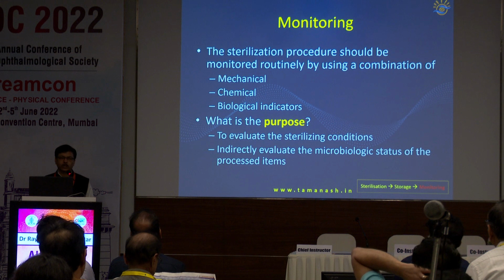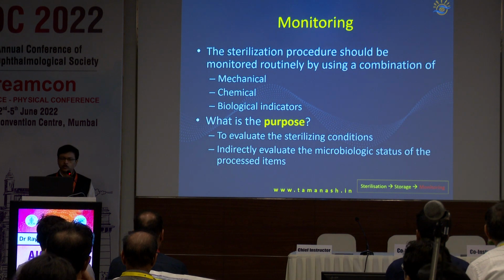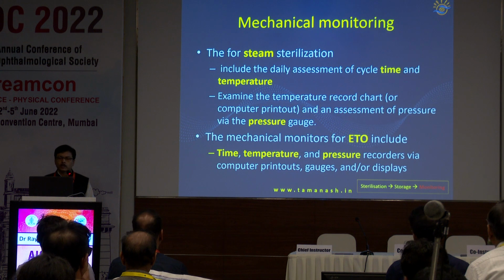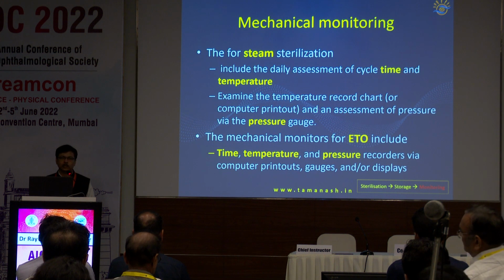So whatever monitoring technique you use, it will always be indirect. It is important to understand that. There is mechanical monitoring, which is as important. You should take a look at the printouts or maintain a log. If you don't have a printout system with your autoclave, you should maintain a log of when it was put into the autoclave, when it was taken out, how much maximum pressure was generated, and what temperature was generated.